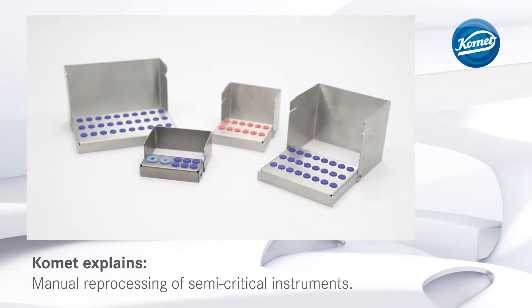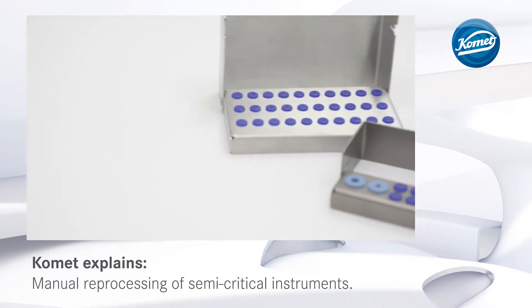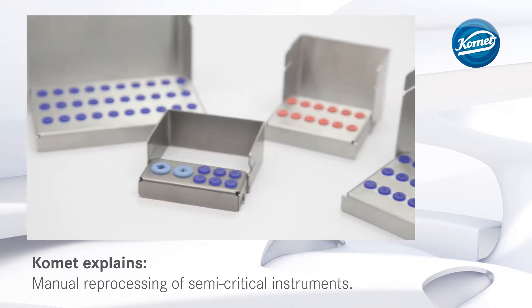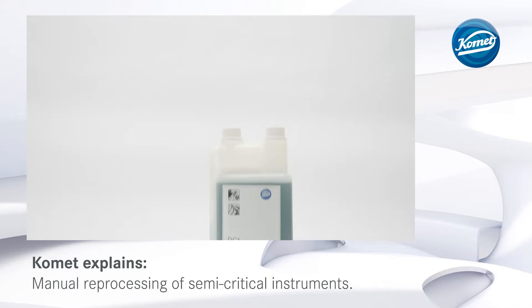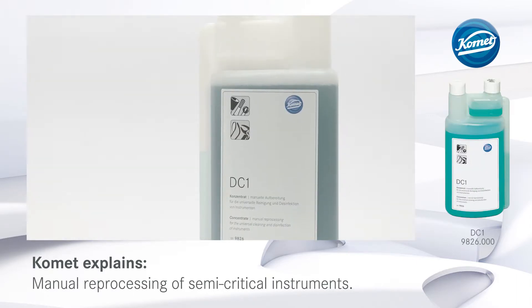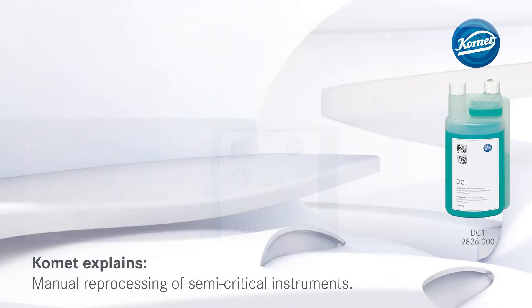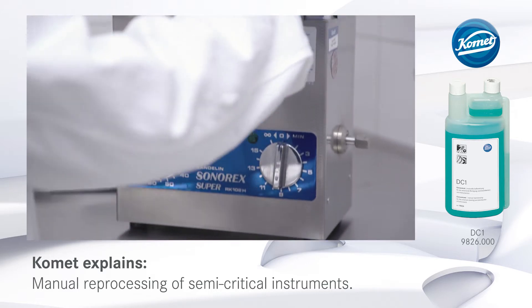This also prevents the rotary instruments coming into contact with each other and holds them safely in place during the process. The burr block is then placed into an ultrasonic bath filled with suitable detergent or disinfectant, for example DC1. Make sure to observe the immersion time and concentration indicated by the manufacturer of the agent.